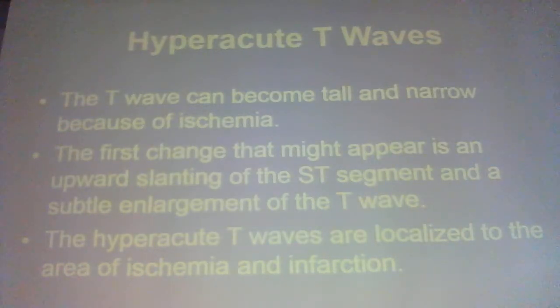All right, so what's a hyperacute T wave? A tall T wave, but it's not pointed. Okay?